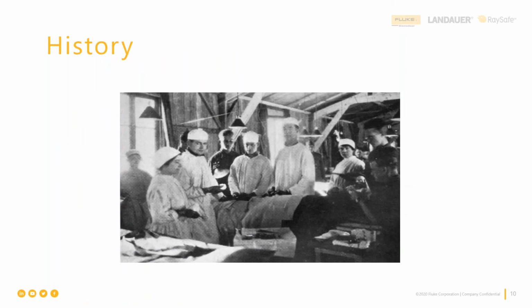So I'd like to jump into a little bit of the history here. Before pulse oximetry, there was really no quick way to analyze the oxygen content of blood. Instead of the non-invasive way we do it today, they could do it invasively by drawing real blood and then running tests on it. And that took time that patients couldn't necessarily afford, especially on the operating table under anesthesia. You have a patient system that's under stress. So before pulse oximetry, thousands of patients died of undetected hypoxemia, which is a low level of oxygen in the blood, simply because of the time it took.